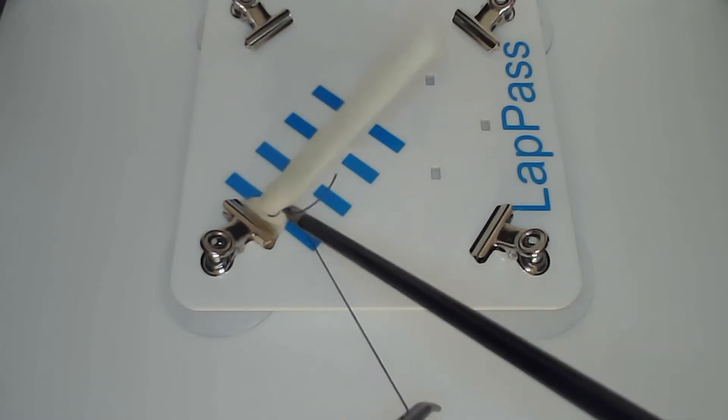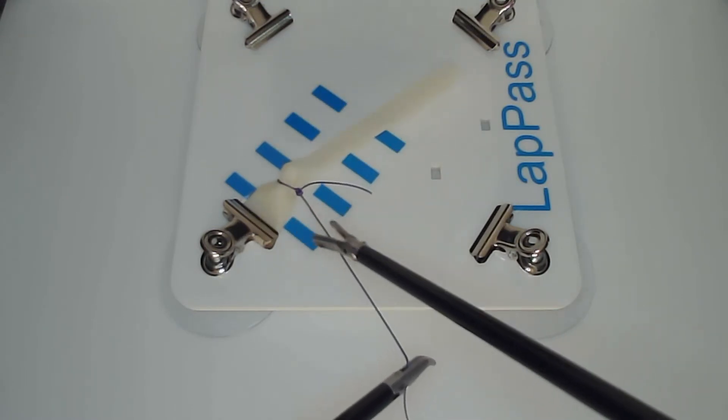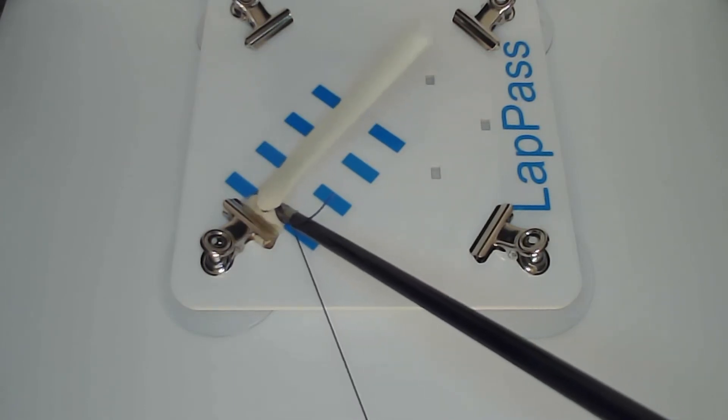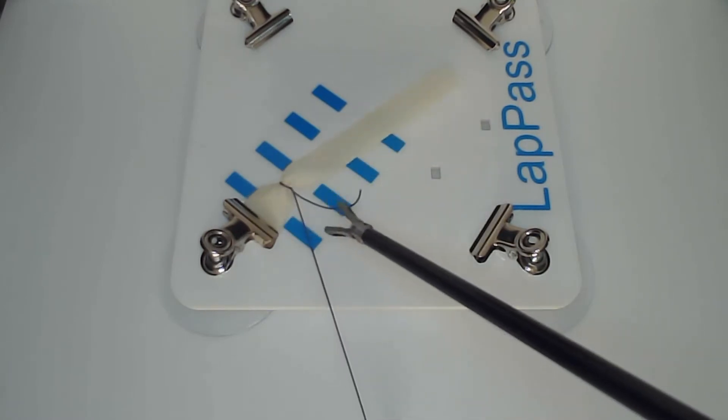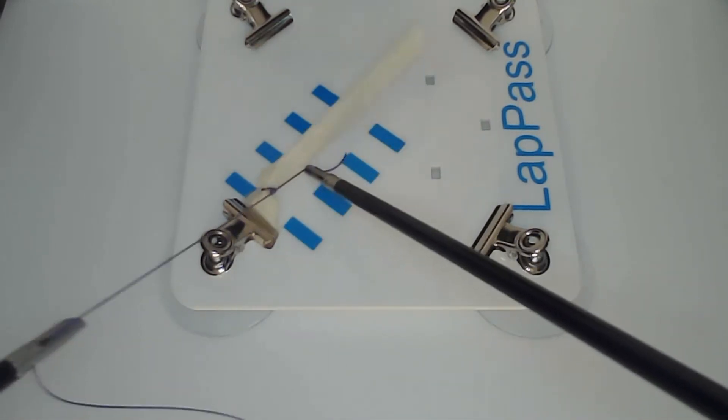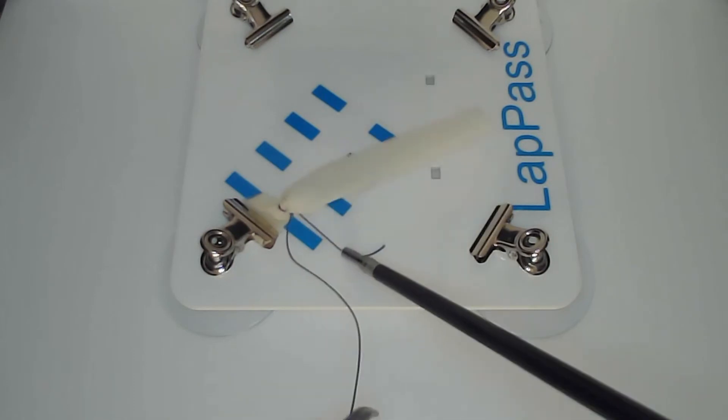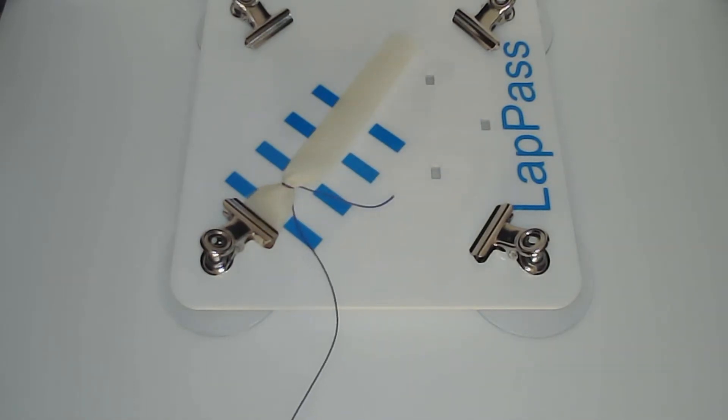As you can see on this model, it's designed to simulate a laparoscopic appendicectomy. You have four lines which create three separate zones: the proximal zone where we're suturing at the moment, the middle zone, and then the distal zone.